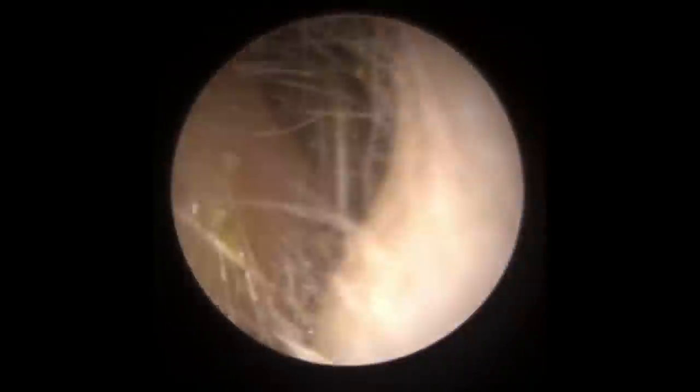There we go - you're just starting to see, now we're starting to get towards the outer part of the ear canal. We're going to hit a catch-22 in a minute because this is going to come out to the outer part of the ear canal, but it's going to be too wide to fit out of the canal itself. I can't maintain a good enough grip to hold on to it with the fine end. So at some point I'm going to have to switch to the wider end just to remove this, but only on the outer part of the ear canal. I'm just trying to break as much of this down as I possibly can before switching tools, because if I can make it slightly smaller, I have a good chance of getting this out quicker using the larger tools.